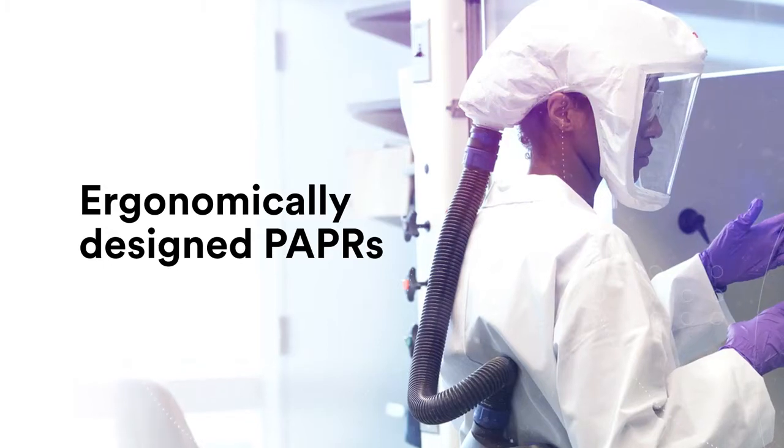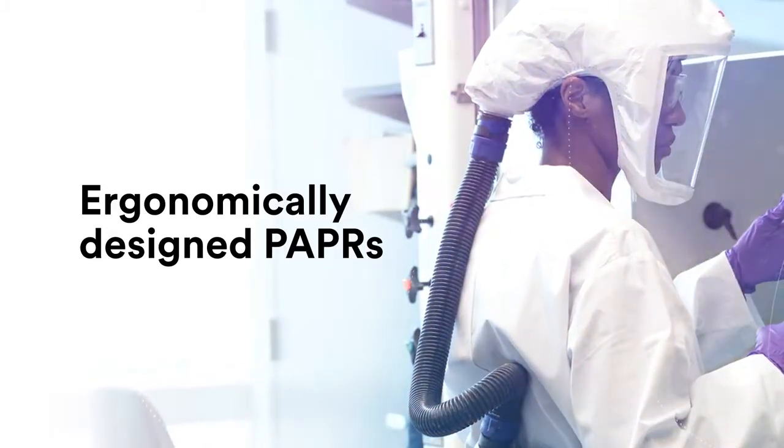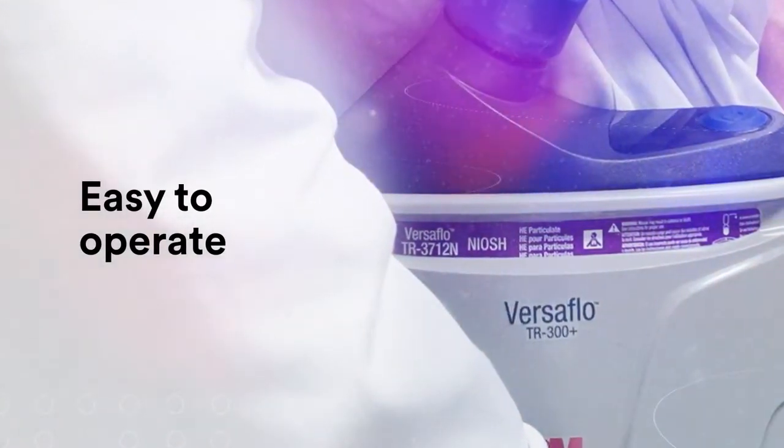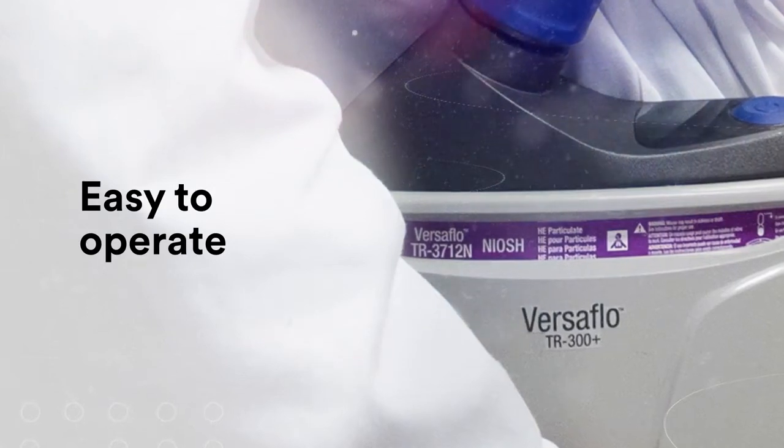The ergonomically designed PAPRs provide balanced weight distribution, comfort, and mobility. They're also easy to operate, with color-indicated interaction points and new battery charge and filter life indicators.